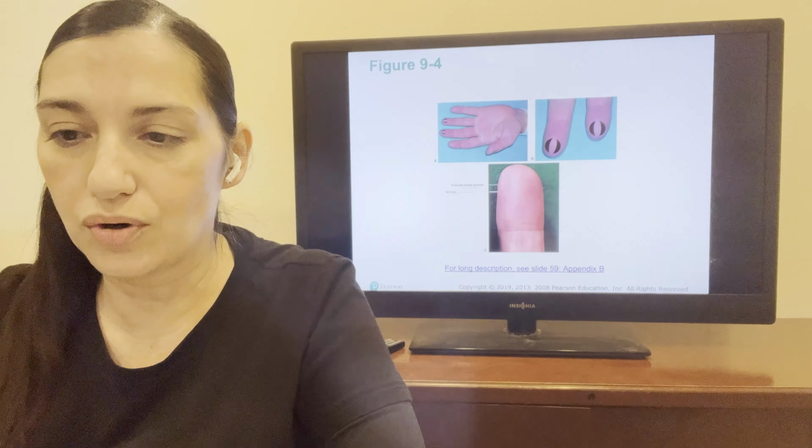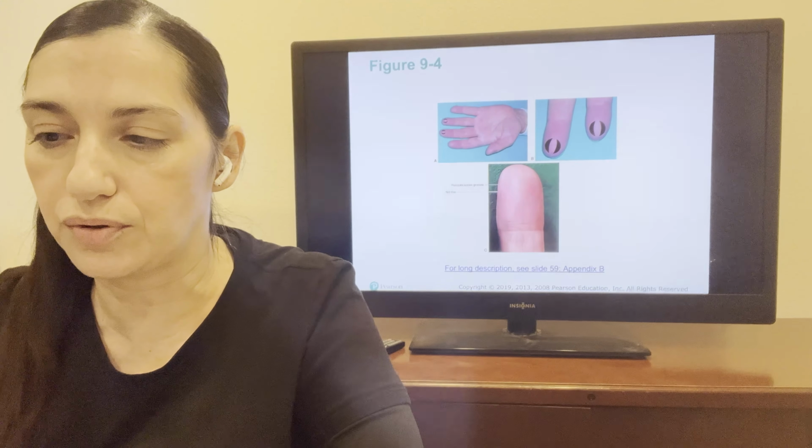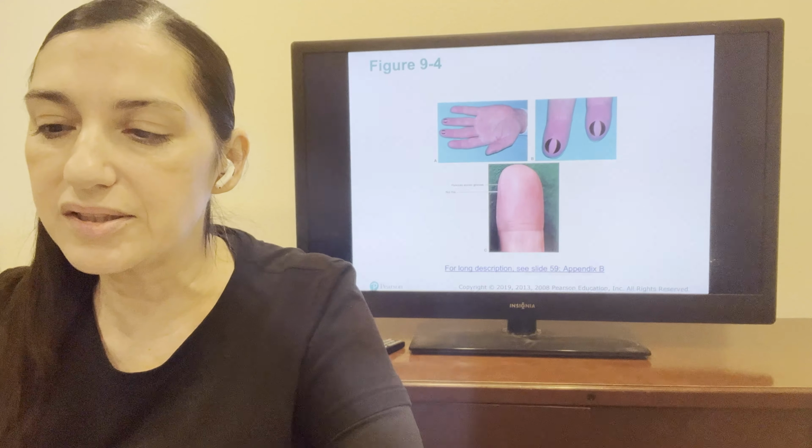In figure C, the fingerprint grooves are often hard to see, but if visible, the dermal puncture or incision should be across the grooves instead of parallel to the grooves. This helps form the rounded drops of blood. If the incision is parallel to the grooves, the blood tends to run into them and is harder to collect.